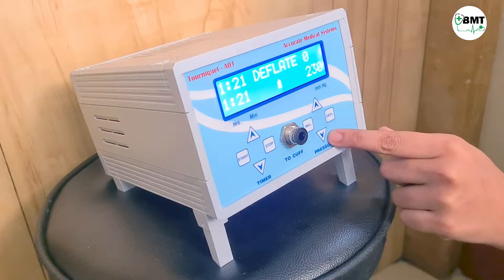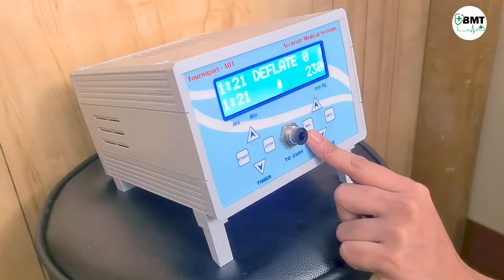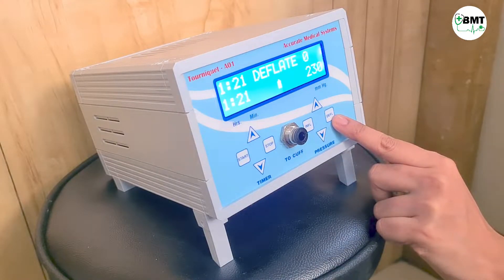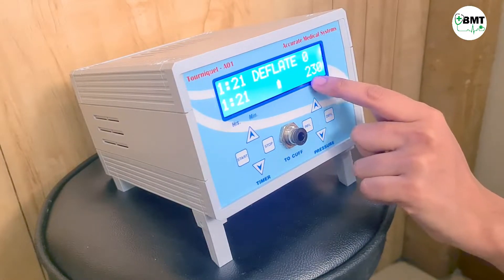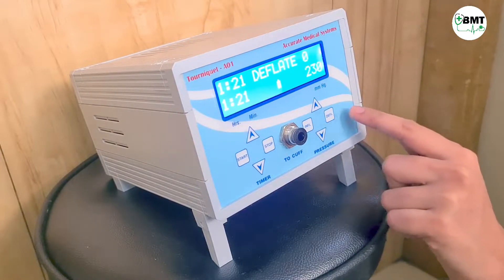From here you can increase or decrease the pressure, and from here you can inflate or deflate the cuff. Once the pressure is set, you can inflate or deflate the cuff accordingly.